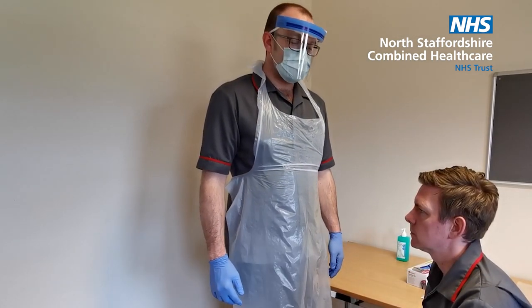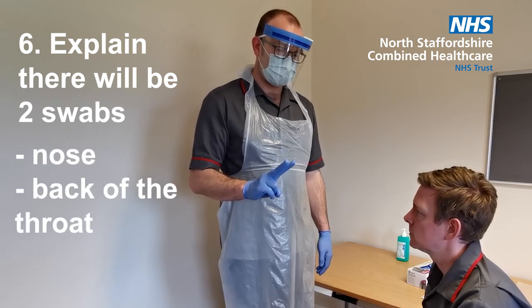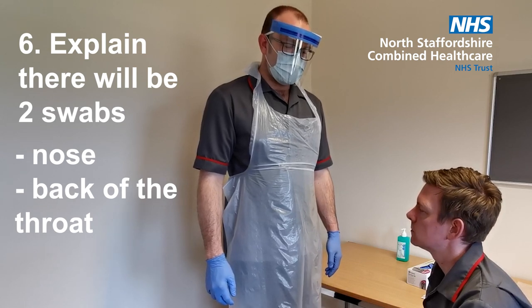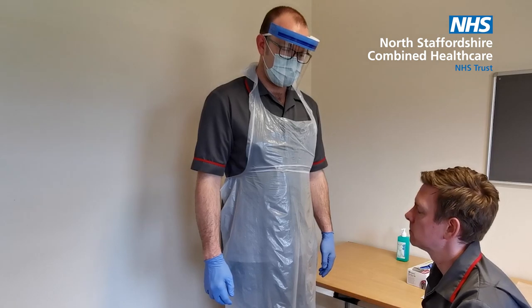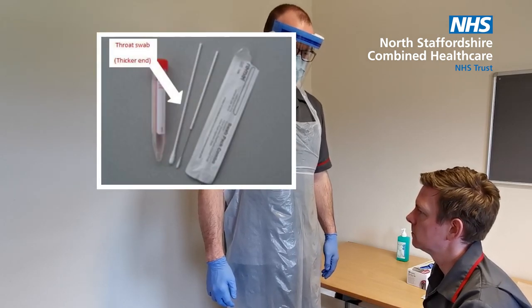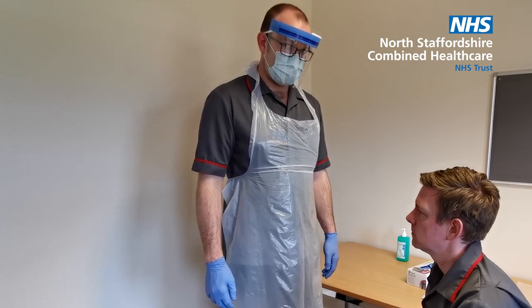So now comes the taking of the swab. Explain to the person that this will involve two swabs — one at the nose and one in the back of the throat. Explain that it might feel a bit uncomfortable, especially the nasal swab. This is the nasal swab and this is the throat swab. Following the procedure, both swabs go into the transport medium tube.